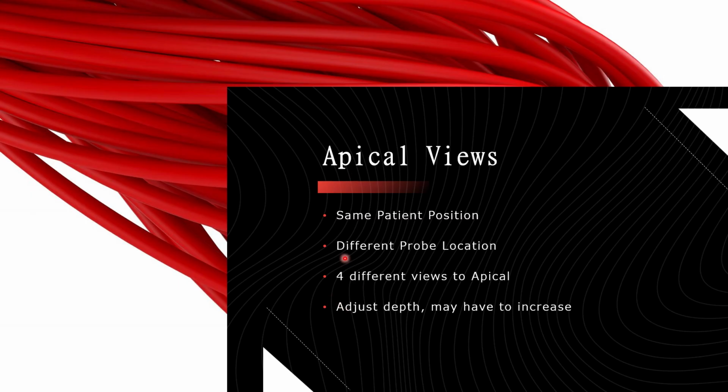Review: same patient position, different probe location, 4 different views to the apical, and we're going to increase our depth.